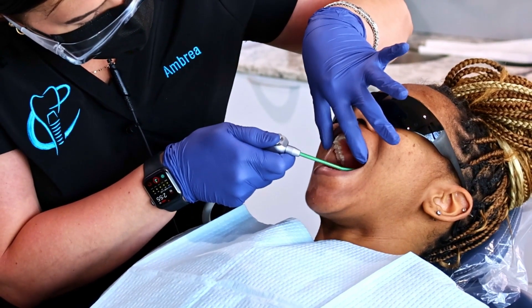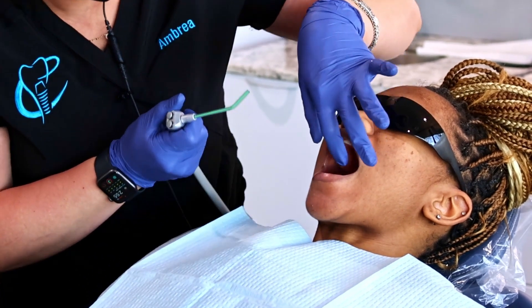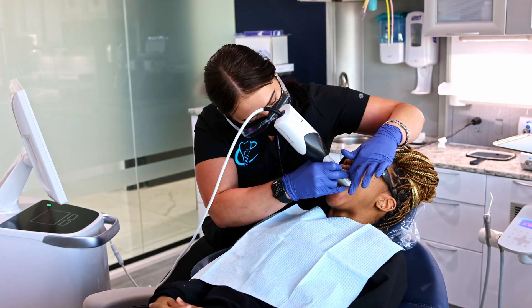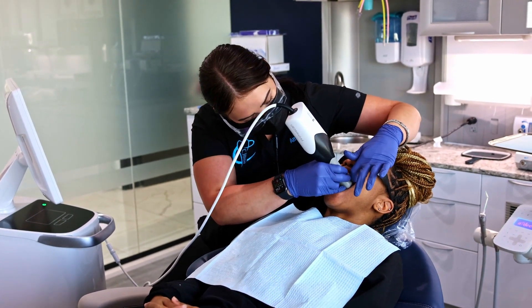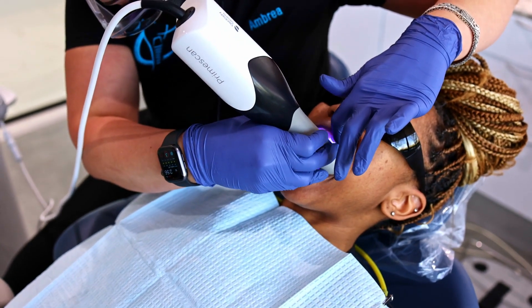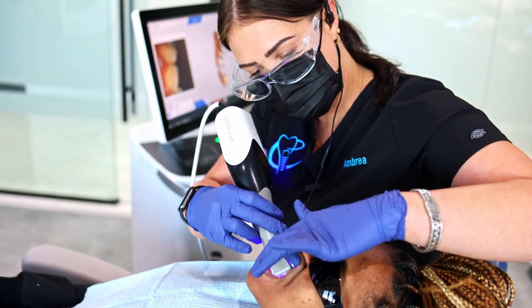Go ahead and open. So it's going to be just like this. And then just stay open for me here. Scanner ready. Go ahead and start scanning. Close down slightly. Great. It's going to look good.